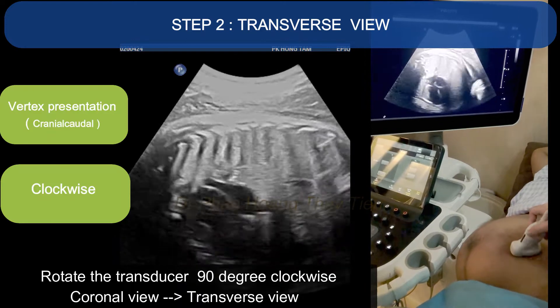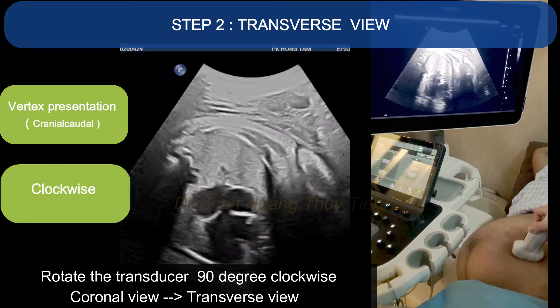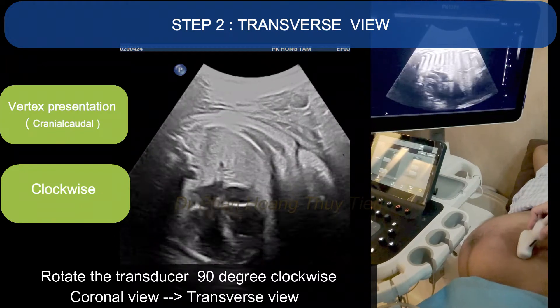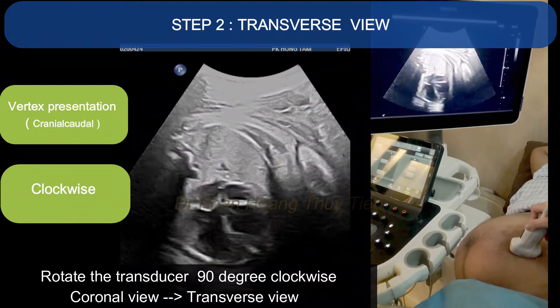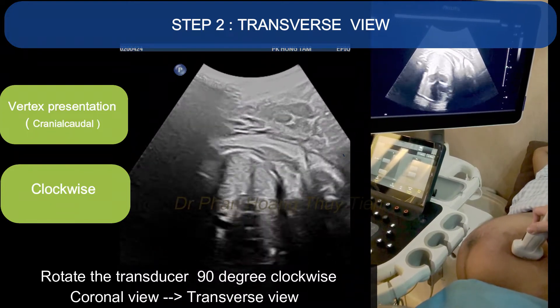Step 2. Since it's a vertex presentation, you need to rotate the transducer 90 degrees clockwise to obtain the transverse view.